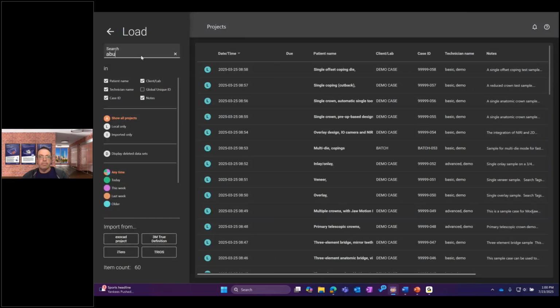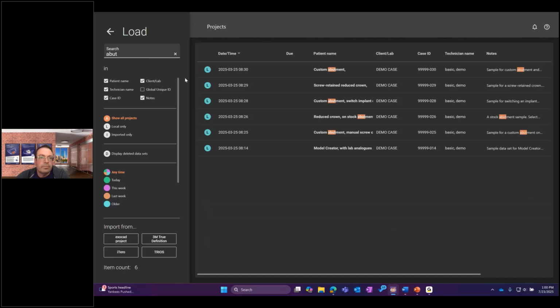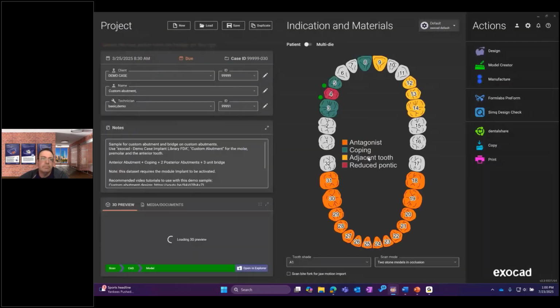Lucas, while you're loading that, we did get a question on when the version's available for end users. At this point, we can't disclose an ETA for the actual full release of the software. But the public prototype, for you resellers on the call, you do have the option to distribute the public prototype to the end users. I would just throw in the disclaimer that it's not really intended for production at this point.